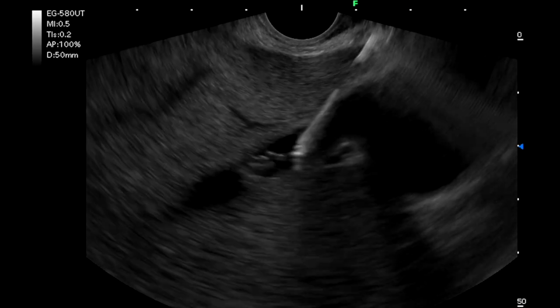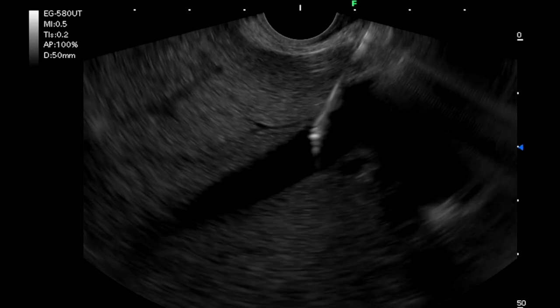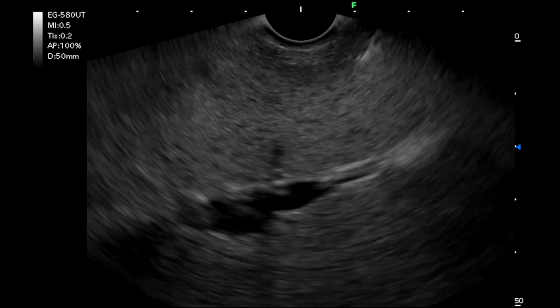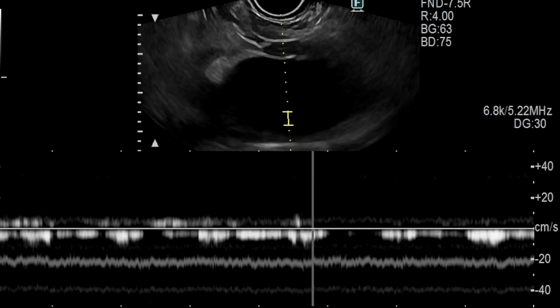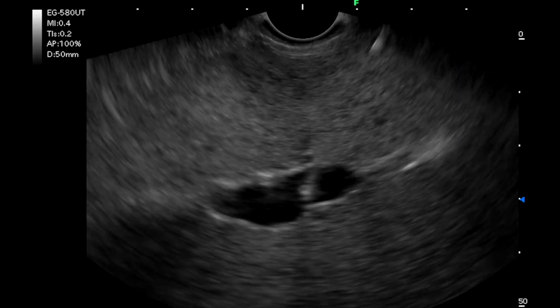and after infusion of 1 milliliter of saline, 3 pressure measurements were obtained, and the average reading in this patient was measured as 15 millimeters of mercury. The needle was slowly withdrawn, and the portal vein was identified by its characteristic thick wall and continuous vascular flow. The portal vein was punctured, and the average of 3 readings was obtained to be 28 millimeters of mercury.